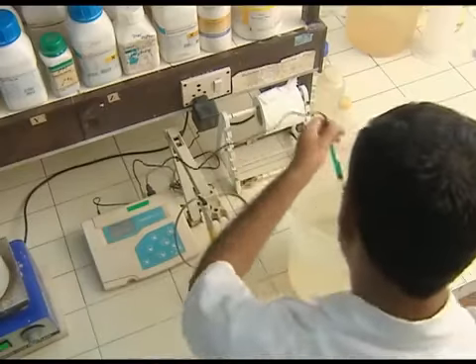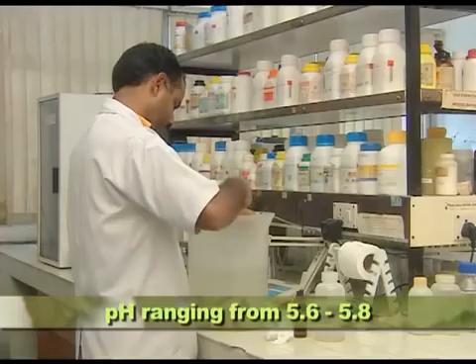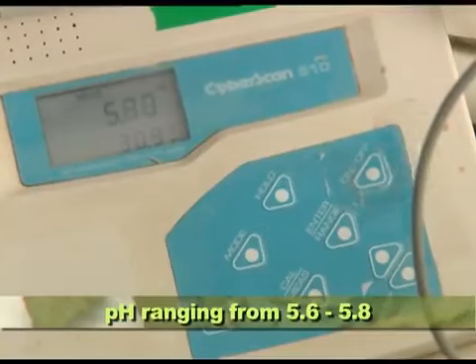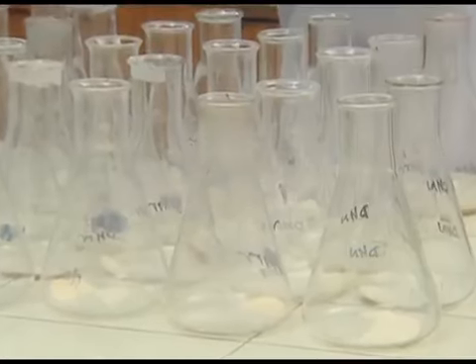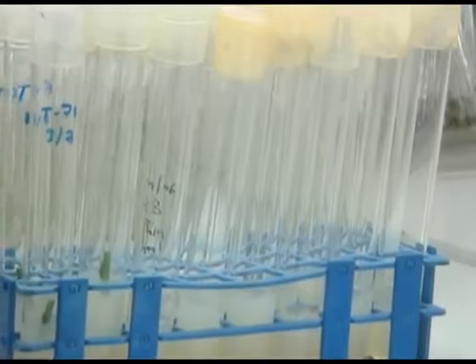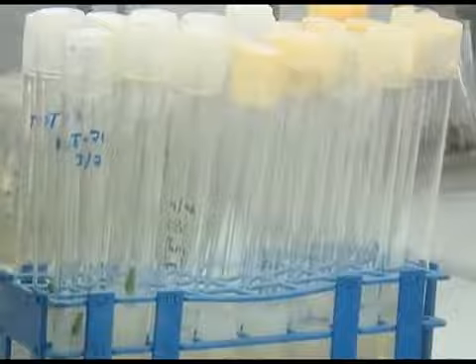Generally, plants can take up nutrients at a pH ranging from 5.6 to 5.8. After the medium attains the desired pH, it is ready to be poured into 250 ml Erlenmeyer flasks or into 50 ml test tubes as 100 ml or 20 ml aliquots.